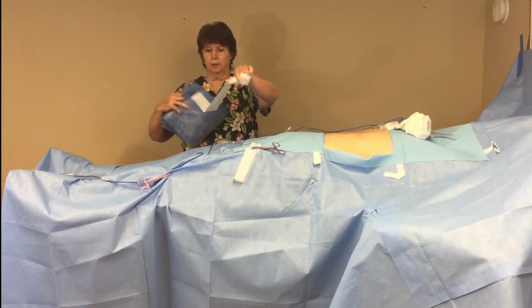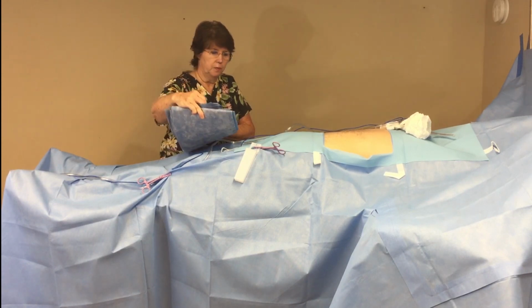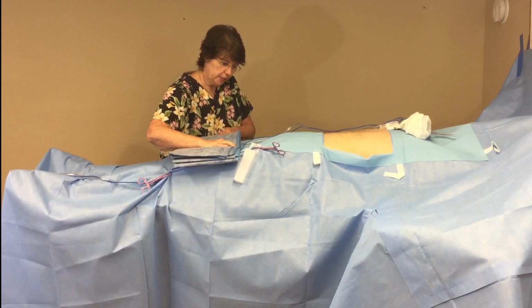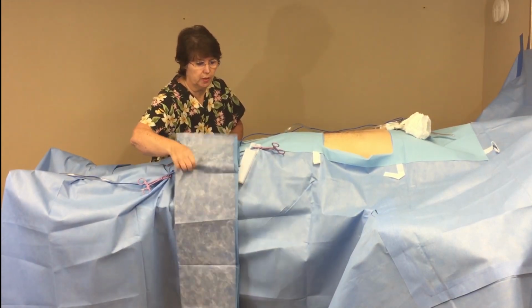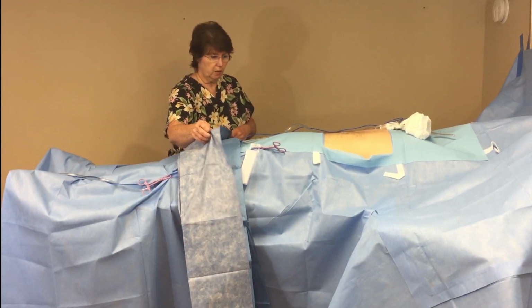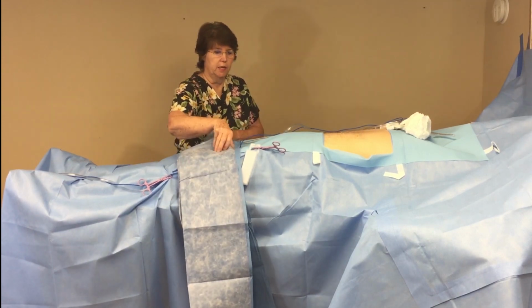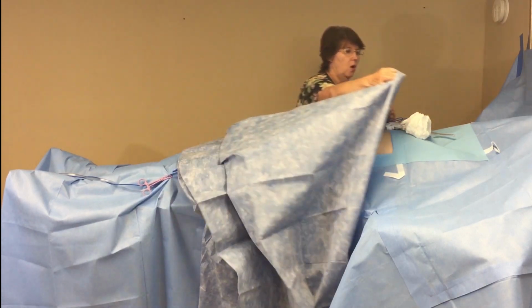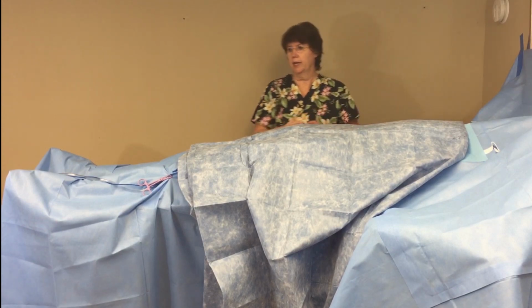So you take the sticky off of it and you lay it down across, and you want to seal it down. Bring it down on either side. Person on the other side would bring it down. This side's not all the way flat. I hope that one is. You bring it up over your sterile field, over the operative site.